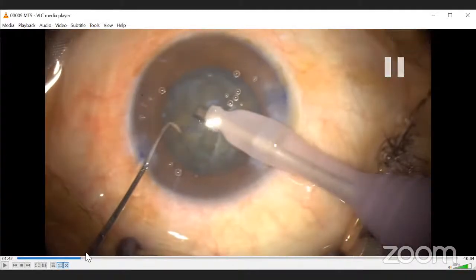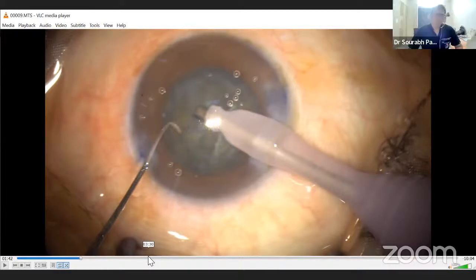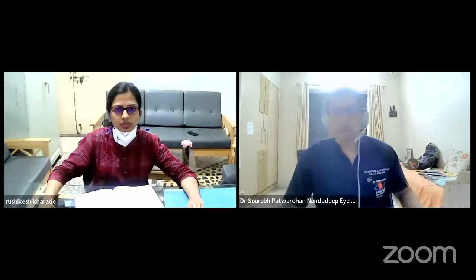Was this torsional or longitudinal? That time I was using torsional only. That's fair enough. Basically, if your attempts fail, then it's better to shift back to trench divide and finish. For softer grades, it will happen more often. But try longitudinal chopping, it is much easier. Yes, sir.